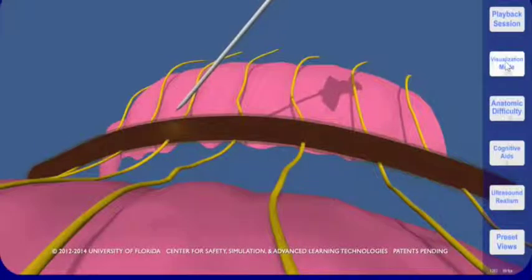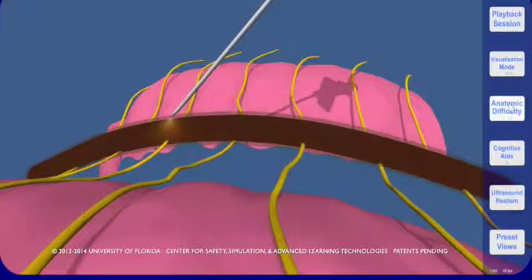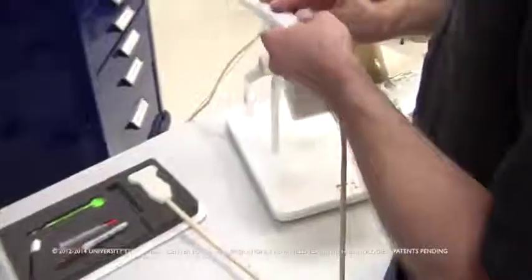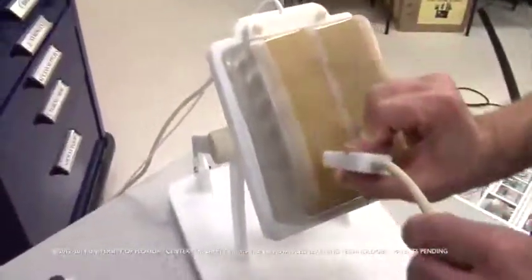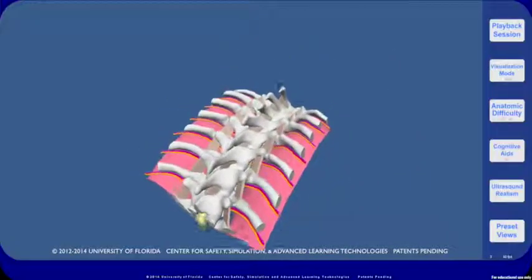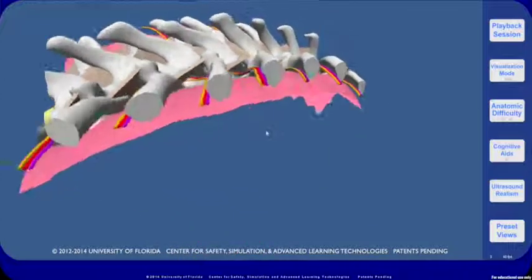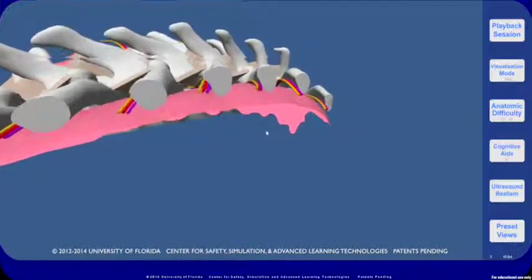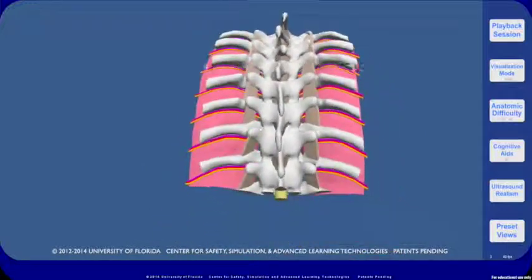The level of difficulty can be varied by increasing or decreasing the diameter of the subdural space. The viewpoint of the virtual model can be controlled via the virtual camera pointer. Hold the button on the virtual camera and move around the physical model; the virtual viewpoint will follow. Release the button to freeze the virtual camera's position.